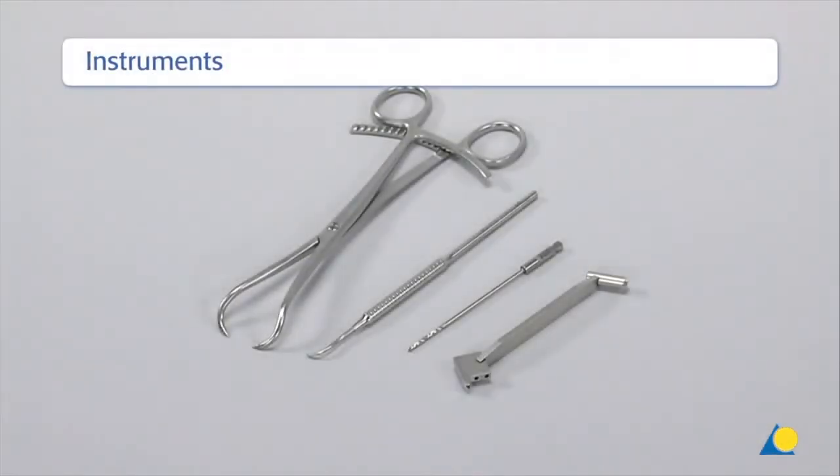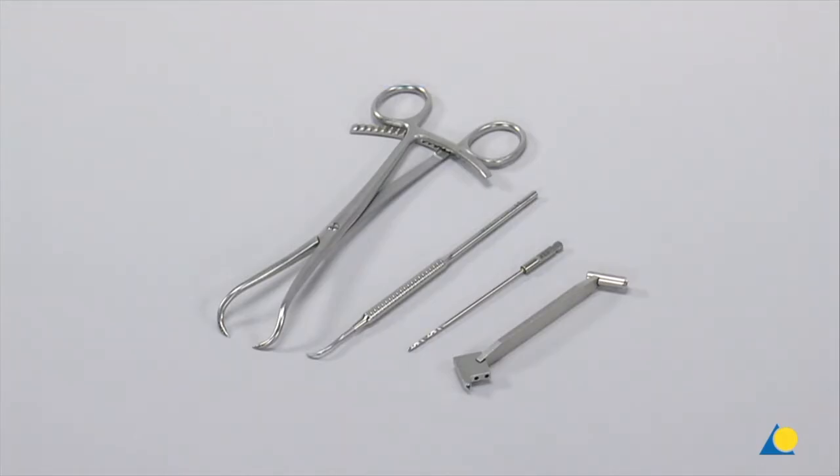The instruments used are from left to right, the large pointed reduction forceps, the sharp hook, the 2mm drill bit, and the 2.0 triple drill guide.